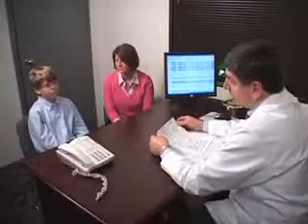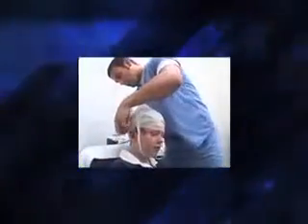When referred to a neurologist for a potential seizure disorder, the physician will examine you and obtain your medical history. If the physician feels that diagnostic testing is warranted, an ambulatory EEG test may be ordered. This is an accurate way to diagnose both epileptic and non-epileptic seizure disorders. Diagnostic EEG testing can be done on an ambulatory or at-home basis.